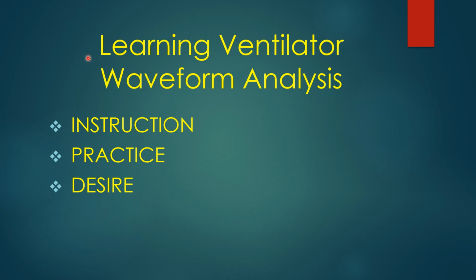So to get good at ventilator waveform analysis requires that you get some instruction. It isn't something that you can just start looking at ventilators and figure out all this stuff about the waveforms. And there are some good books out there on ventilator waveform analysis. Also, there are YouTube videos to watch that will be very helpful in giving you the kind of instruction that you need. But practice is where you're really going to learn ventilator waveforms.